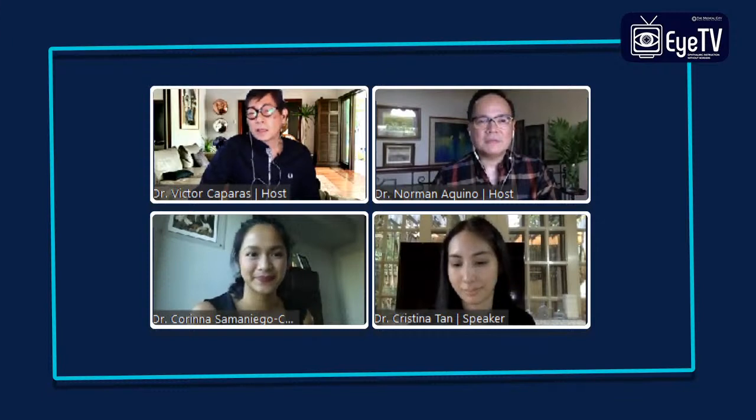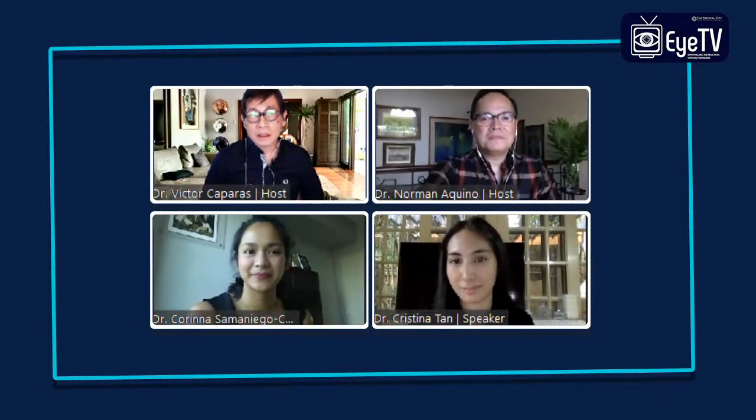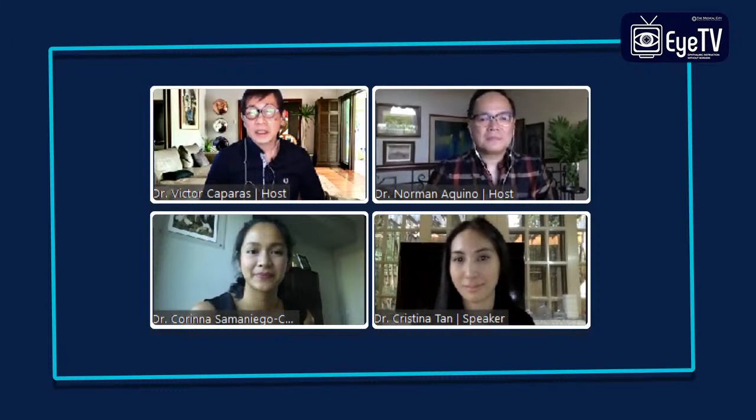Now, to segue into the next segment, you might be wondering why a cornea guy and a glaucoma guy are co-hosting a cornea show. You have to realize that the technology we're going to discuss next has its origins in air puff tonometry, which is still very much used in checking IOP. And the genius of Oculus was to put in a high-speed camera which was able to detect a dynamic change, or to image dynamically the cornea as it was indented.